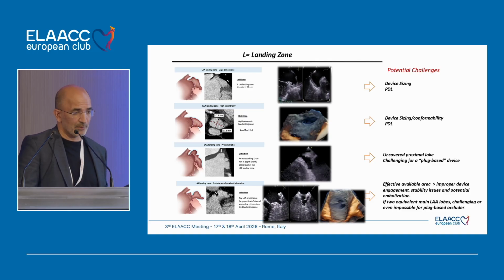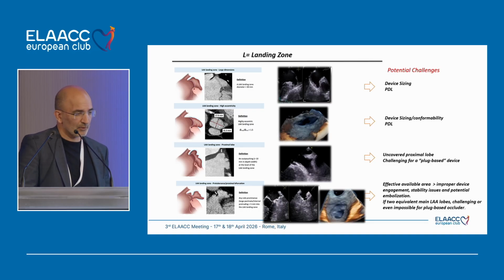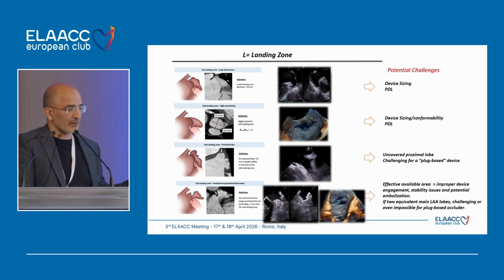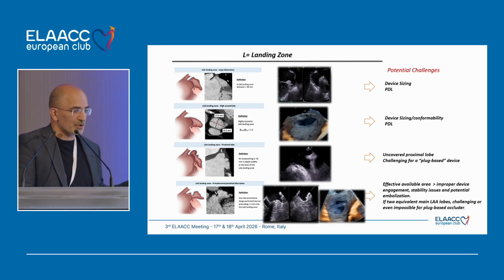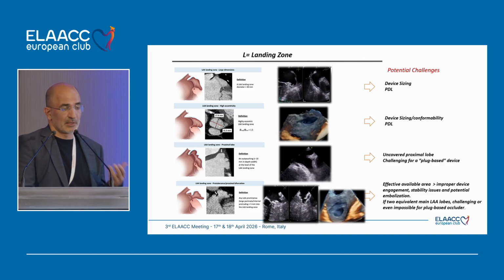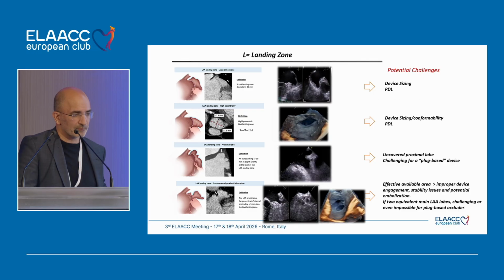The fact to have a proximal lobe that could lead to an uncovered proximal lobe, challenging for a single component device. And also the fact to have a protuberance or any kind of proximal bifurcation, also with a clear definition. And also this can lead to improper device engagement, stability issues, and so forth.